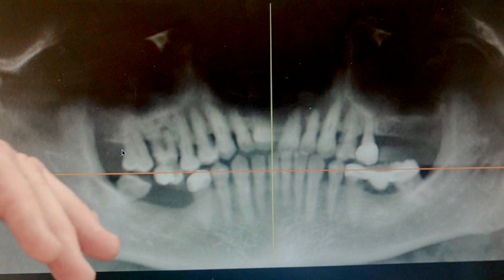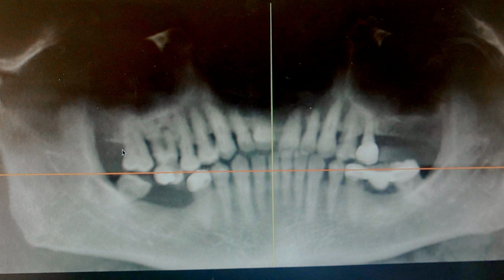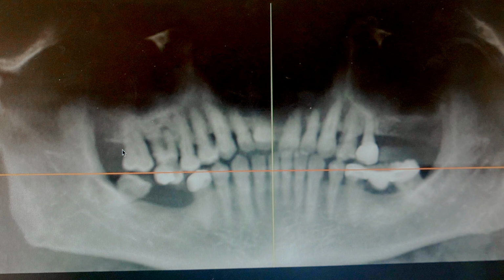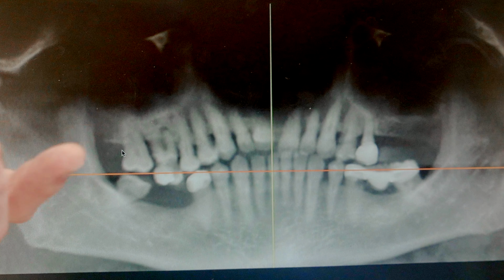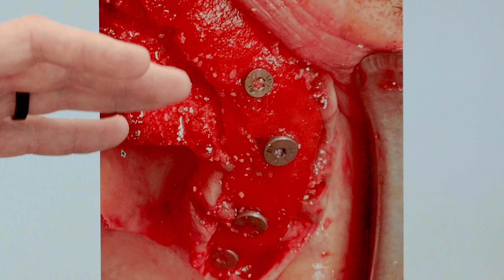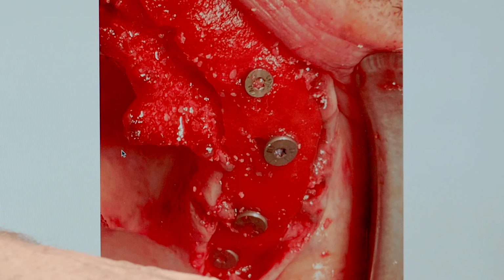in the end it will just look so much better. Here is his preoperative x-ray, or the x-ray before we did the extractions, and there's just a lot of stuff going on: deep pockets, pus coming out of a lot of these areas, mobility, loose teeth, broken teeth. And so this required kind of an all hands on deck approach. Okay, we have to do everything on this patient.